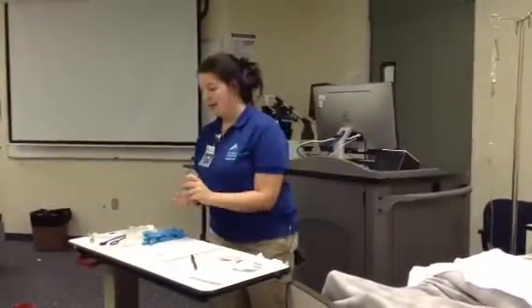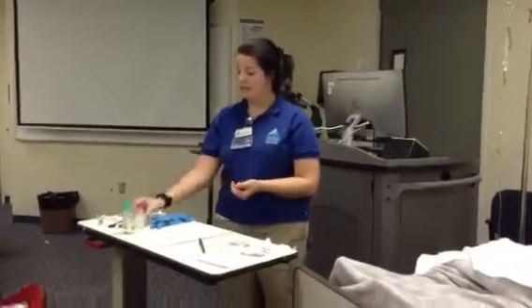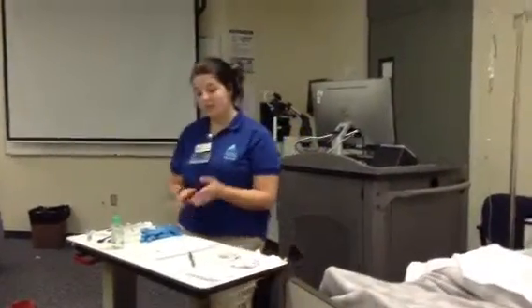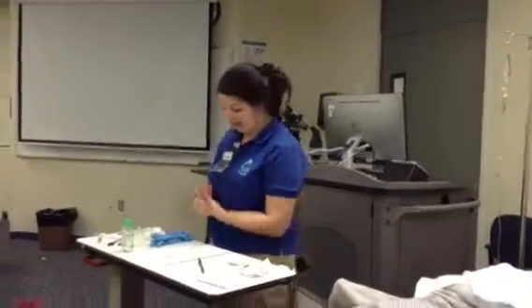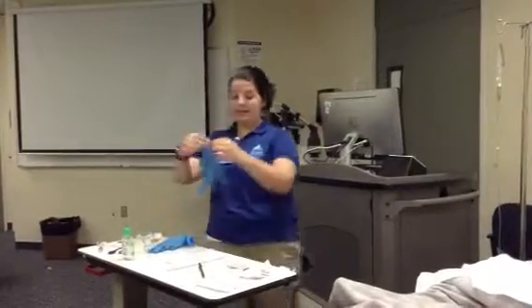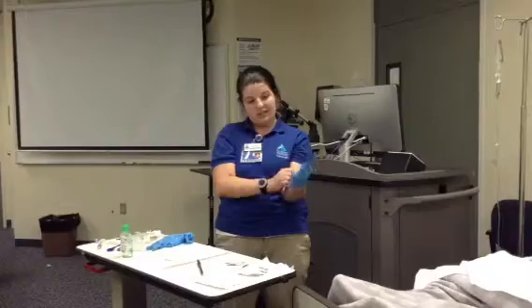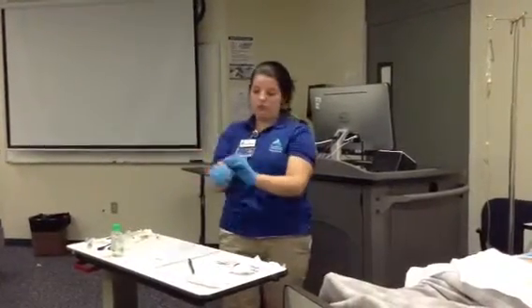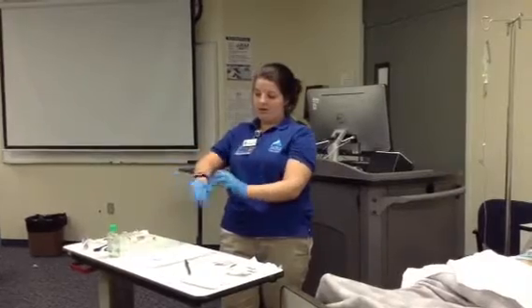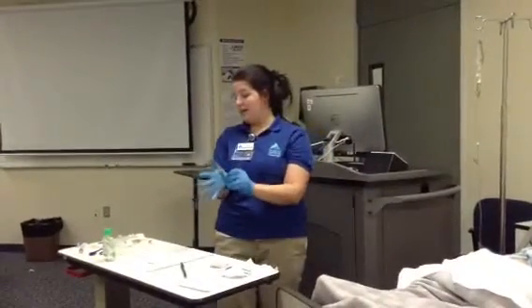Perfect. Okay, so a little bit of hand hygiene, and I checked the expiration date on the bottle. Everything looks good. So we're ready to administer, and I checked on my MAR. I looked at my labs, my allergies, checked my medication once again. Everything looks perfect. Okay, so I'm going to go ahead and get ready to administer my medication. Prepare it.